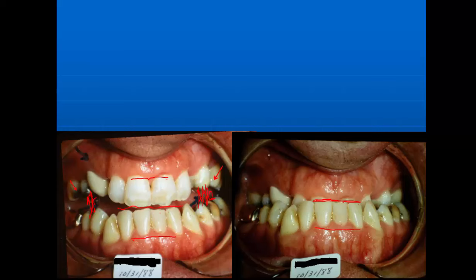Now we came in on this guy's case and just bonded the acrylic across these teeth and left it coming out to where it met on the lower teeth. So when this is bonded on there, these teeth can't be put together back here. So the man's chewing right up here in the front teeth, and that was kind of irritating to him. Said he couldn't eat. I said, well, you're just going to have to eat like a rabbit, you know.